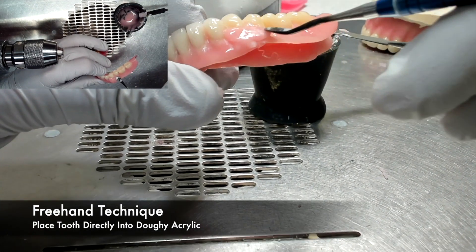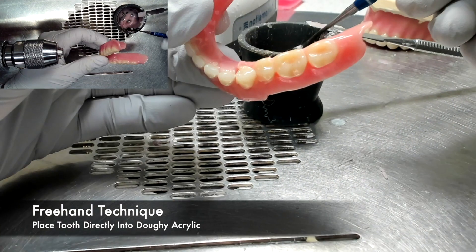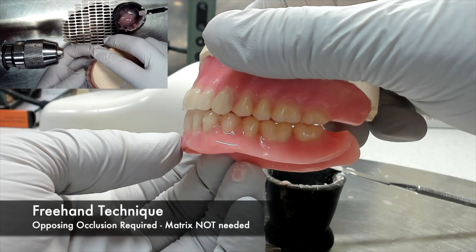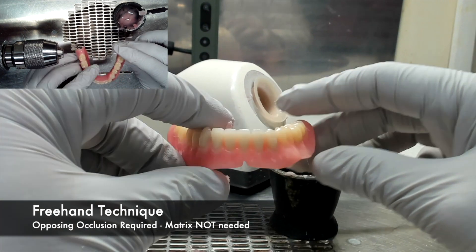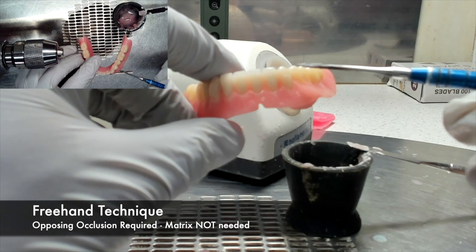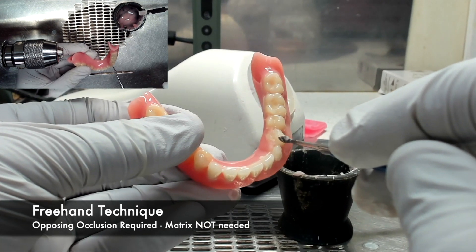To remove excess and to contour acrylic, you can use a tool with wet monomer to remove excess and form root eminences. Although when using a freehand technique you do not need a matrix, an opposing occlusion is required in order to make sure that the tooth is placed properly. Without an opposing, it would be a complete guess as to where the tooth goes in the position of the occlusion.